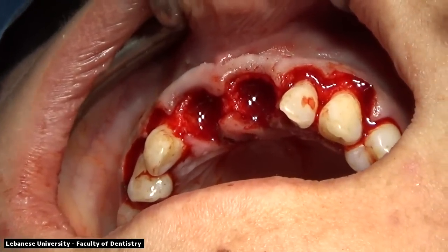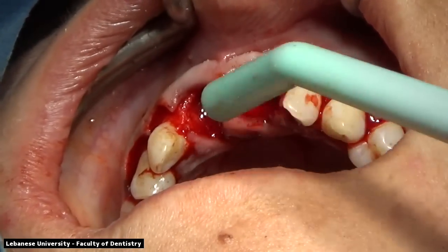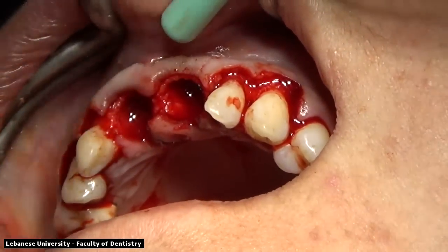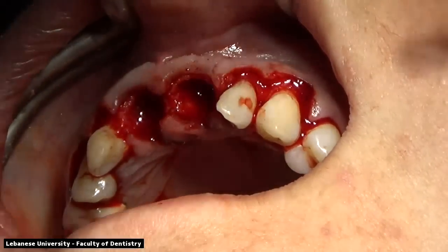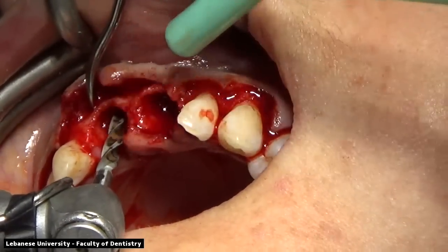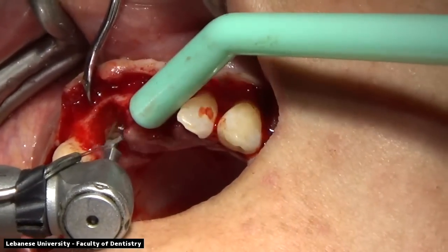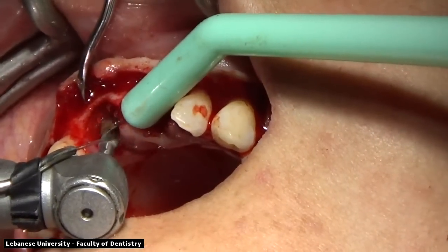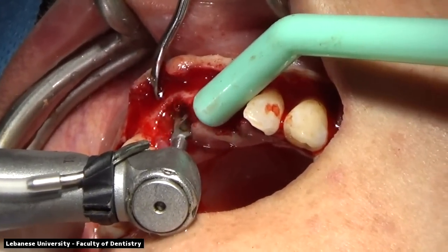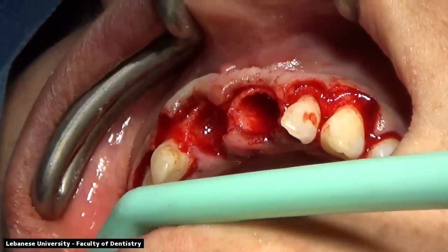Dr. Maalouf, can you let us know how much you're going to be drilling? Like, how deep are you going to be drilling? We're going to be drilling to 13, so the implant length is? The implant length is 12 millimeters. Currently in this socket we have almost 8 to 10 millimeters, depending if it's the right socket or the left socket, but both of them we're drilling to 13 millimeters so that we can get primary stability from the apex, which is the 2 to 3 millimeters additional drilling aspect, and from the palatal surface as well.